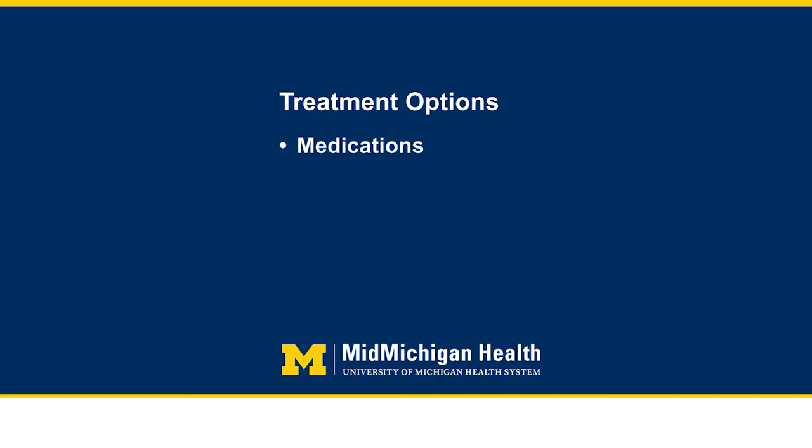For those who are no longer getting good symptom relief with medications, we have two main surgical options: deep brain stimulation and Gamma Knife. Deep brain stimulation is a surgical procedure where we place an electrode in the part of the brain that controls the tremor. This wire is then connected to an implanted device similar to a pacemaker. This procedure is discussed in greater detail in another video in this series.